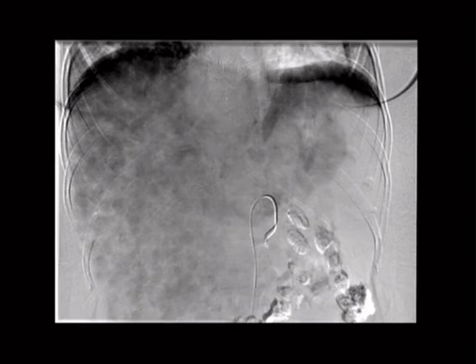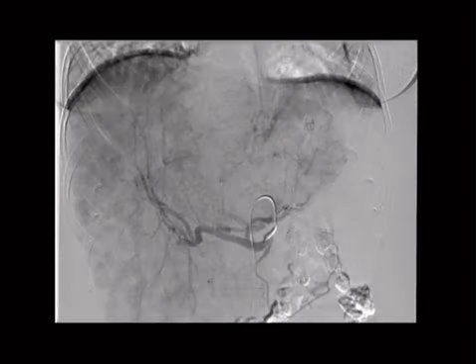So here's an example. Notice that the diaphragms are black like this. That's because they are moving just a little bit. And bowel gas is there also. Probably the reason you're seeing these rib shadows like that is because they're moving up and down. Notice you can hardly see the spine at all, that's been taken out, and that's what it's supposed to do. And then you can do your run, and that blood is something that's moving, so then you're going to be able to see it.